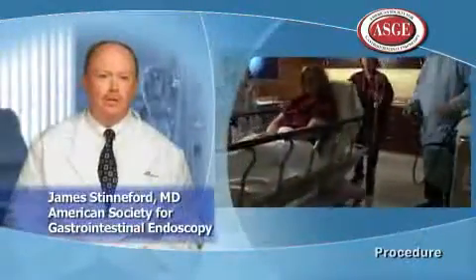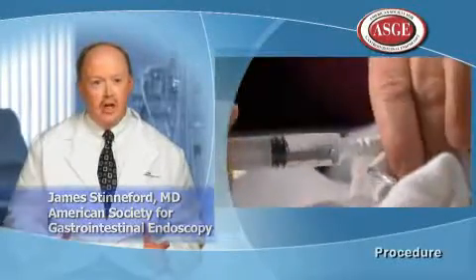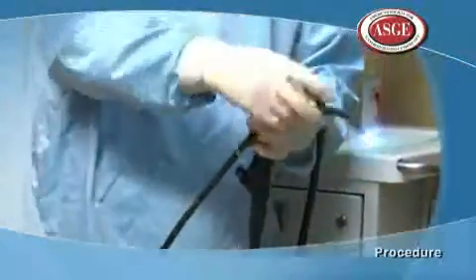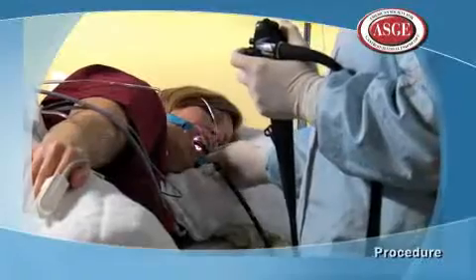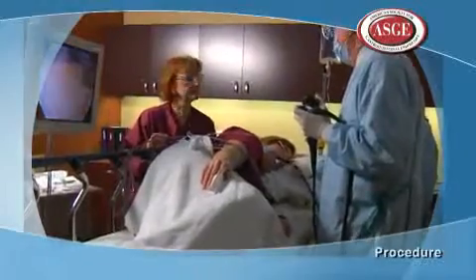Well, the procedure is very straightforward. The patient will be brought into a room and they'll be placed on their left side. They'll receive some intravenous sedation to make them nice and comfortable and sleepy. While they're napping, we'll use a very thin, flexible scope that causes no injury. It's actually smaller than food that they eat. We pass the scope down, take a look around at their upper digestive system, and try to find the reason for the symptoms that brought them there in the first place.